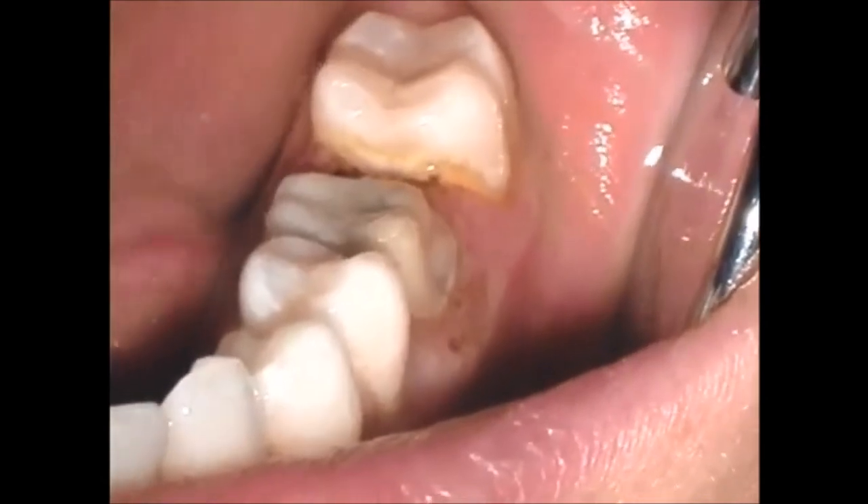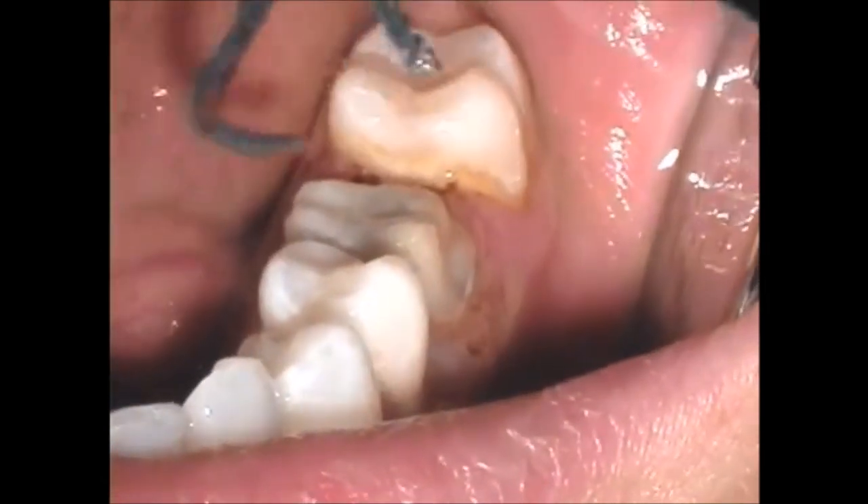Once again, hemostasis is tested with a firm air-water spray. If no bleeding occurs, hemostasis has been achieved and we're ready to pack the cord.